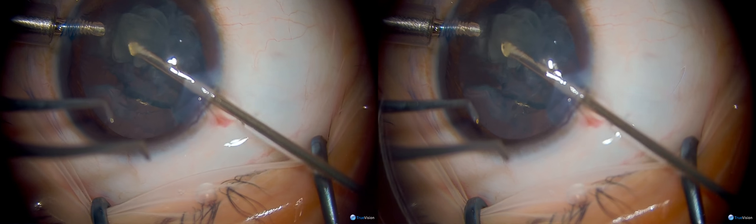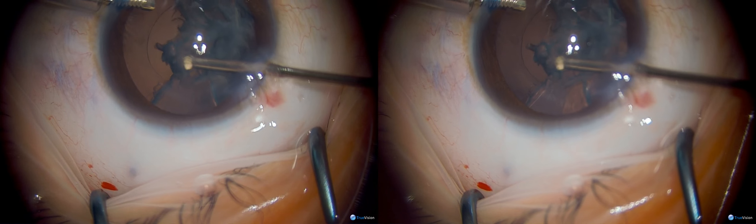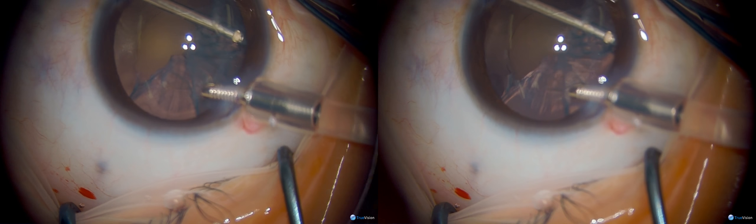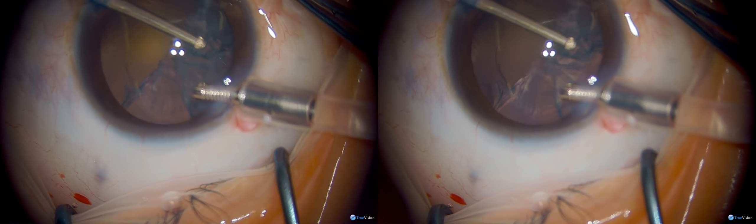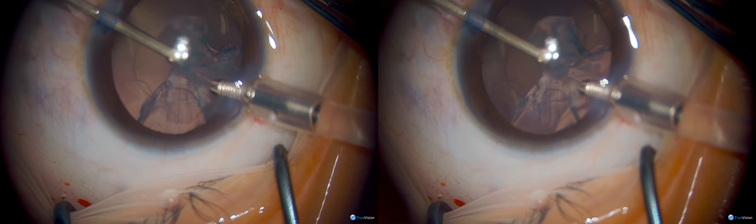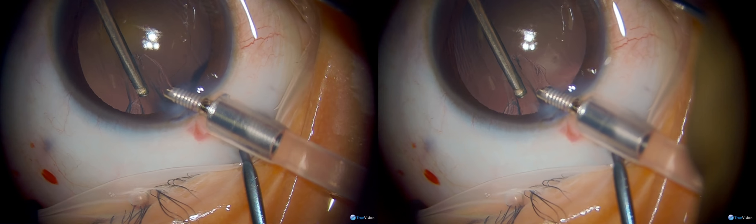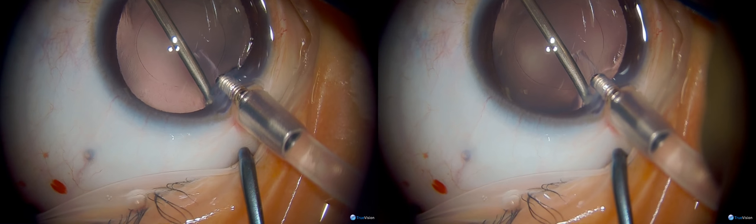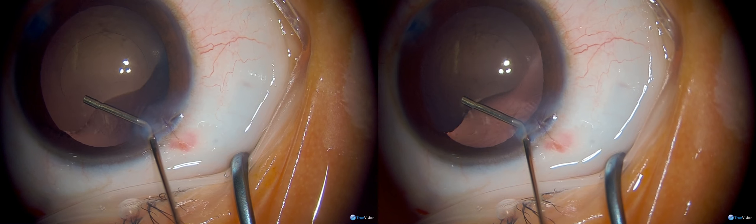The vitrectomy handpiece is mostly being used with the port facing upward. The cortical material is relatively dense so it tends to follow itself out. An advantage of having two ports is you can use a bi-manual technique, simply switching the anterior chamber maintainer and the vitrectomy handpiece to reach that very difficult sub-incisional cortex — quite easy when you go to a port which is 90 degrees or more opposite your primary incision. And our last little bit of cortex has come out.